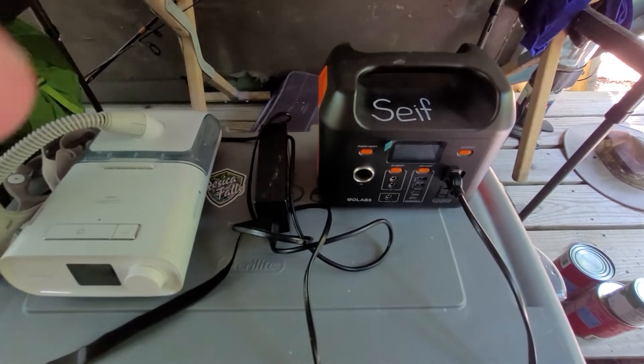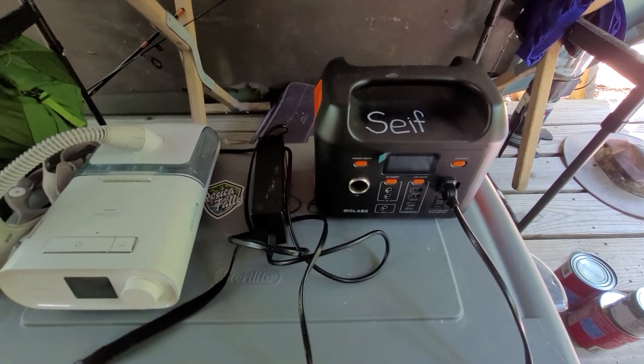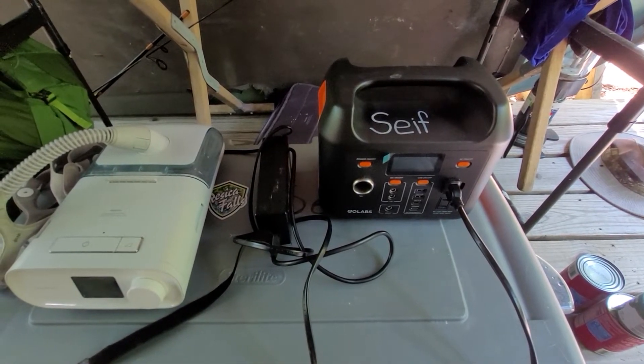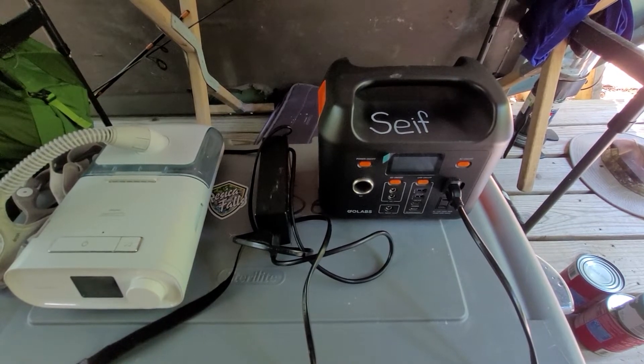Hi everybody, this is my one year review of my GoLabs R300 battery pack for camping with my CPAP. I'll go through what I think of this machine and how I use it for my camping setup.